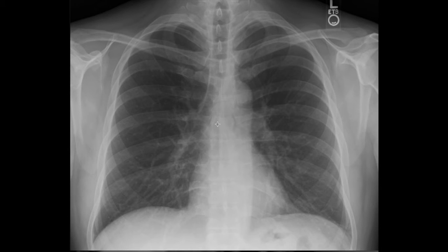Another thing in the evaluation criteria is the marker. Here, this says the left side. Normally the left side of the chest includes the heart. This is in the normal case, but then we have special cases like dextrocardia or situs inversus.